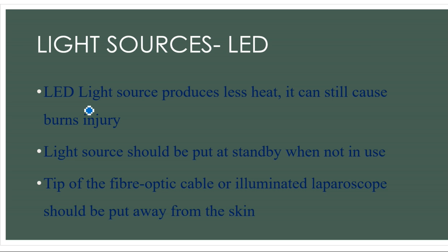So LED light source, although it produces less heat, can still cause burn injury. So again, the same precaution as we have discussed for the xenon light source, we must take in LED also. The light source should be put at a standby mode when we are not using it. These are the precautions we must take while using these types of light sources. And the tip of the fiber optic cable or illuminated laparoscope should be put away from the skin and also away from the internal organs, right?